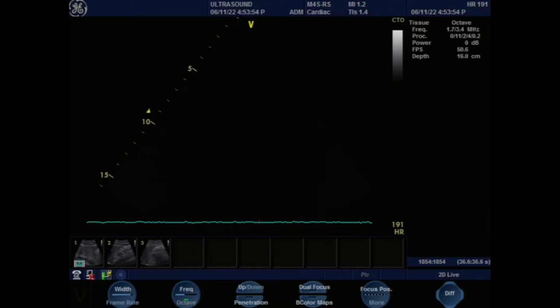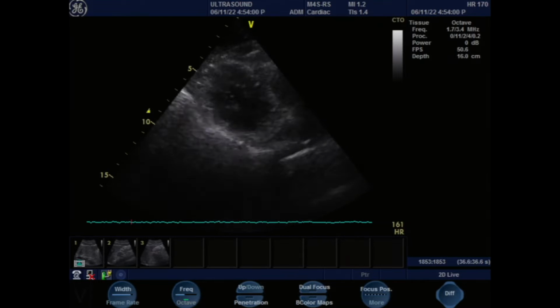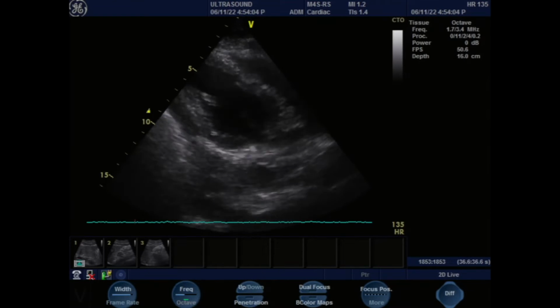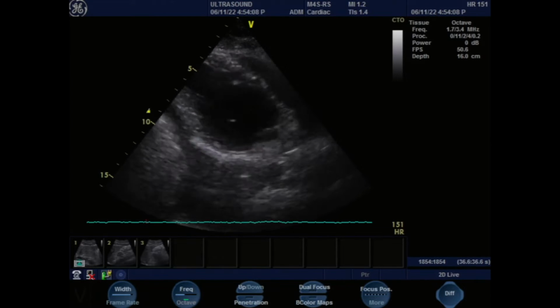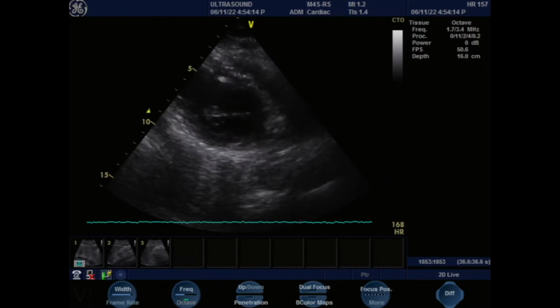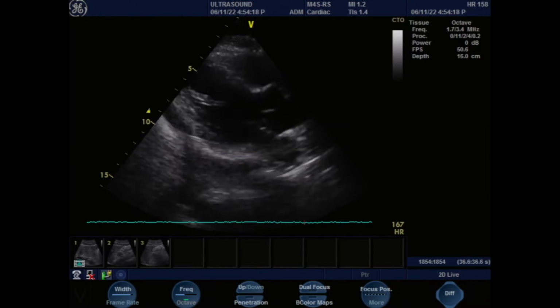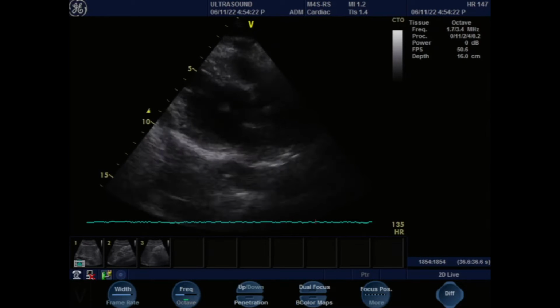Ventricular thickness? You can measure ventricular thickness and everything. All of those measurements are done in this view, usually the parasternal long axis view. When you get the ventricle in an oblong shape, you measure the thickness. You measure the LV septal thickness right here. This is the septum you're seeing. And then you also measure the inferior wall thickness over here. You can measure the aortic size over here. Sometimes in echo they tell you that the aorta is enlarged or what have you. You get all of that from this view.